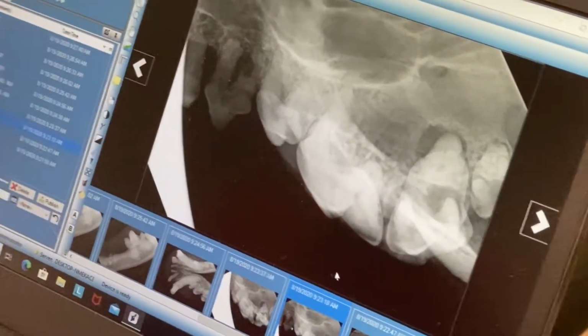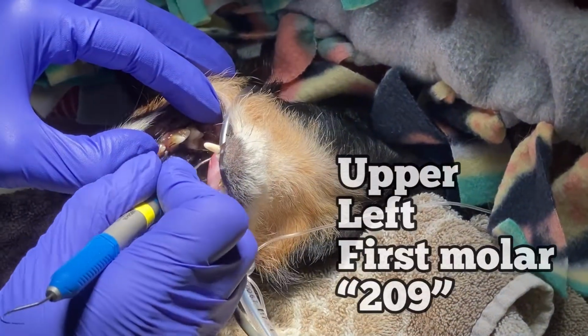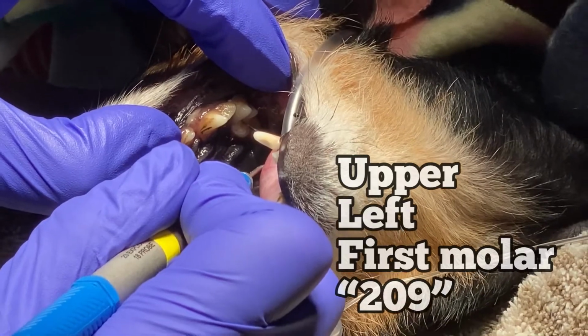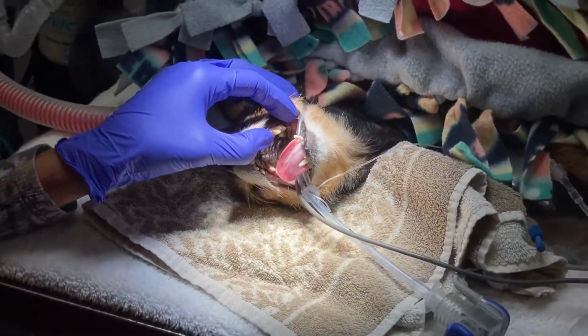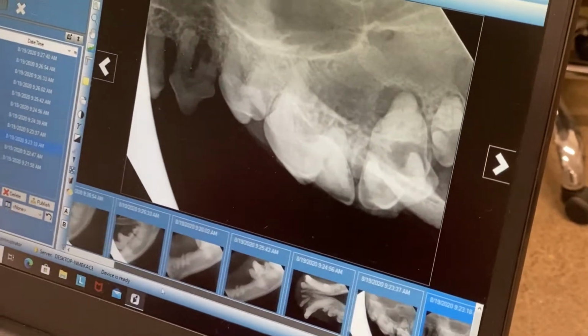And this tooth on the dog is which tooth? This is the upper left. This is that one that we wiggled in the back. Yep, this upper left first molar. Perfect, otherwise known as 209. Okay, perfect. So in a case like this, this tooth needs to be extracted.